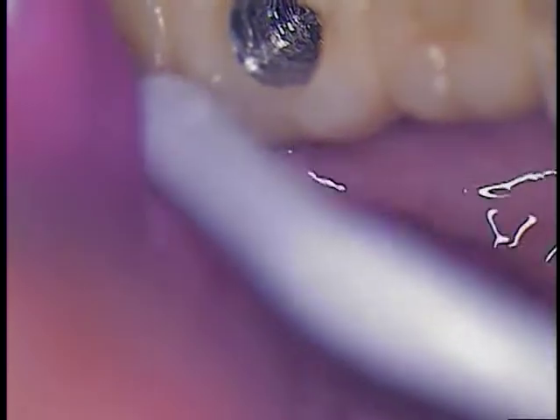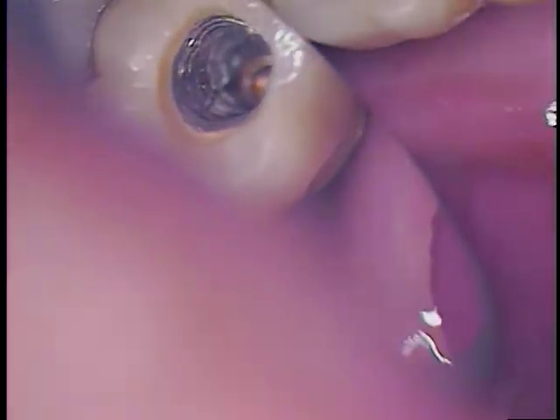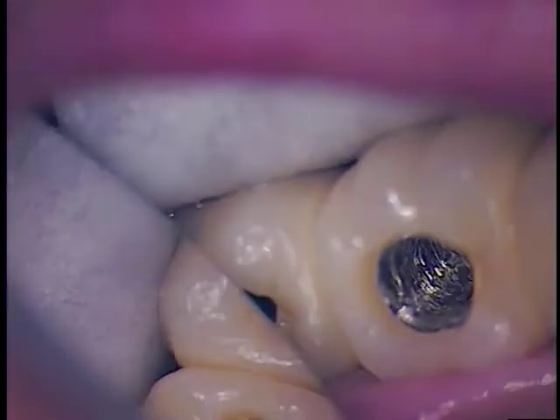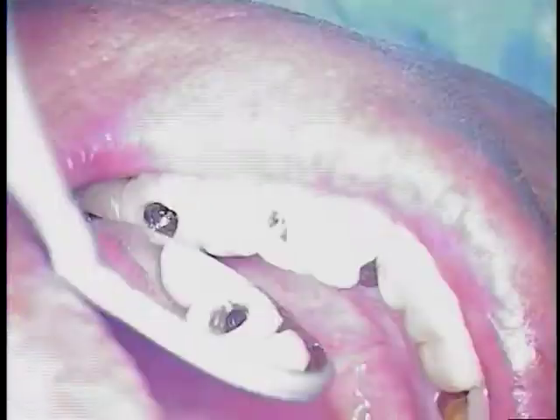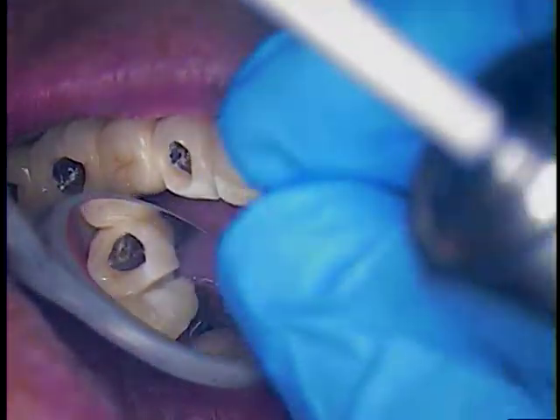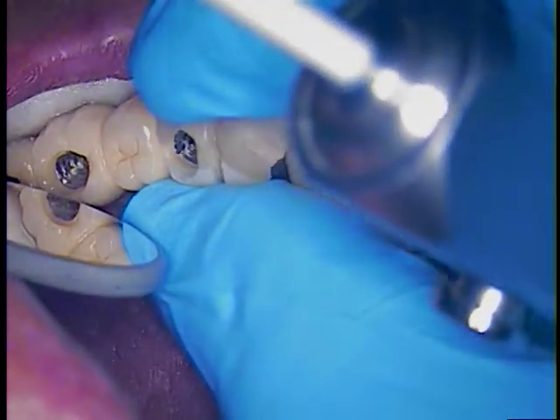We were able to finally gain access to each one of these and we were able to get a driver on them, but there's some path of insertion obstruction. So we can hopefully get the screws. We did bond this bridge to the adjacent natural tooth.